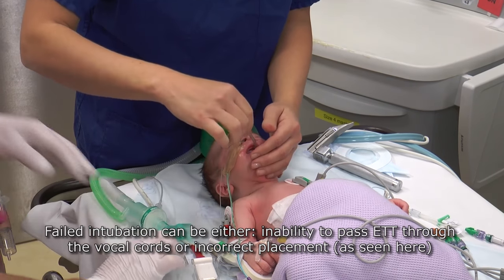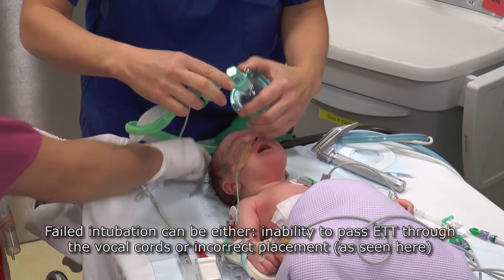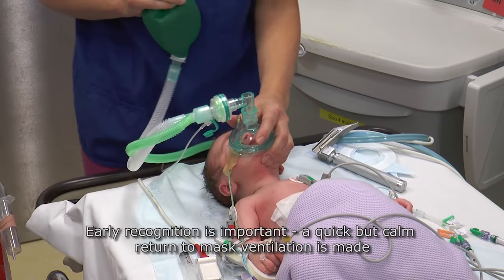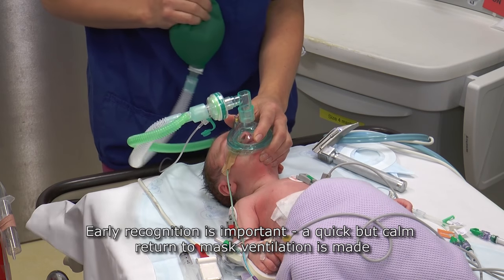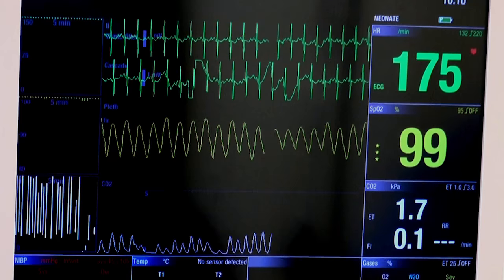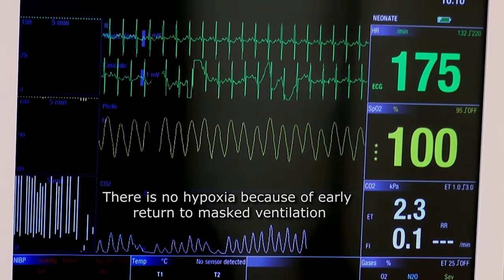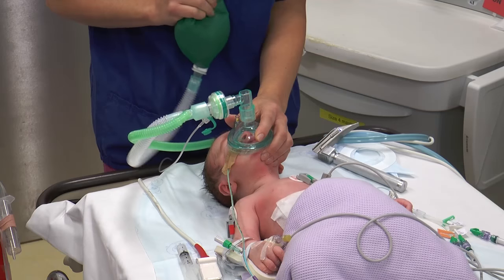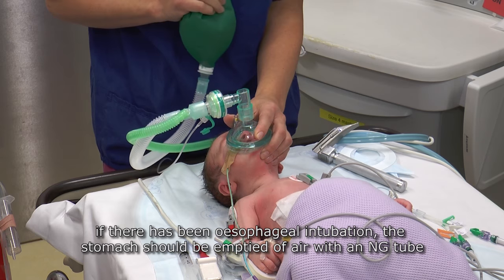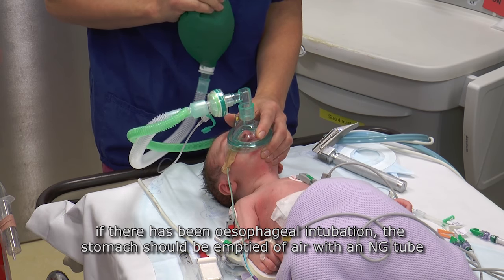Failed intubation can be either inability to pass the endotracheal tube through the vocal cords, or incorrect placement. Early recognition is important. A quick but calm return to mask ventilation is made. There is no hypoxia because of early return to mask ventilation. If there has been esophageal intubation, the stomach should be emptied of air with a nasogastric tube.